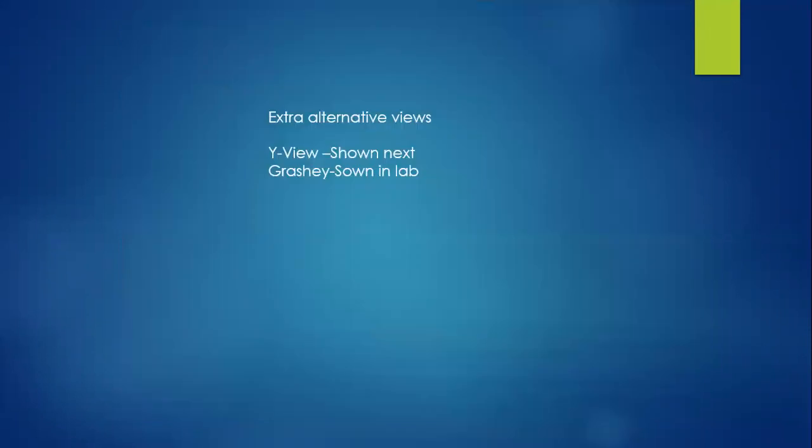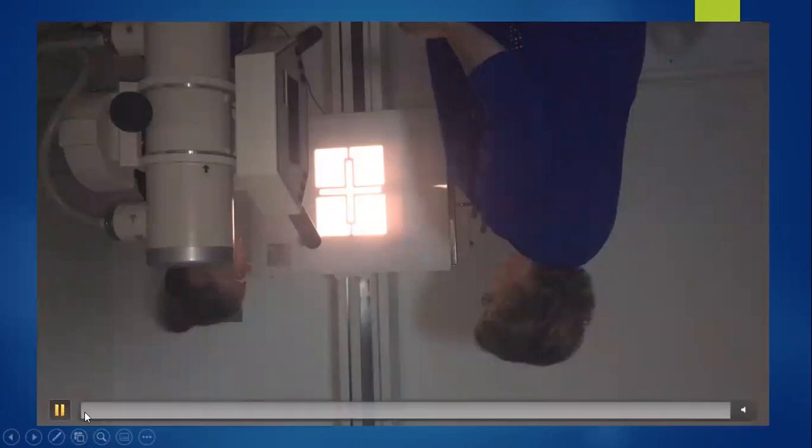There are two more alternative views that we're going to do in the lab. We're going to practice the Y view, which is also in a video here, and we're going to practice the Grashey, which is going to be shown in the lab. I don't have a video for that. That is where we're going to look in the joint. The Y view is going to be used for dislocated shoulders. So let's look at the video of the Y view and I'll talk about it.